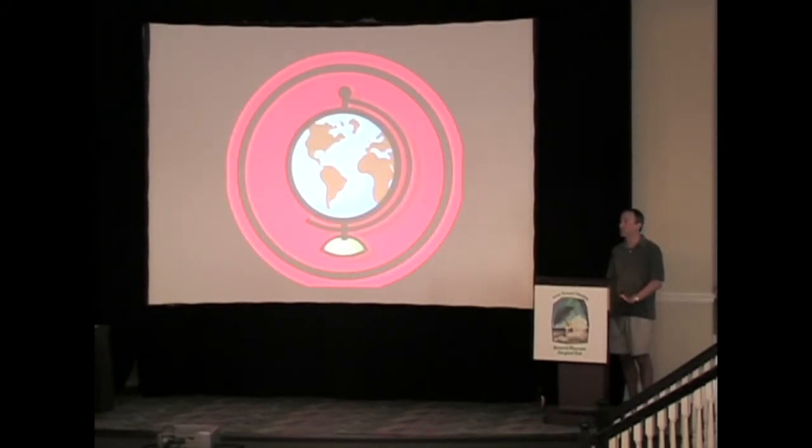And this image is just to remind me of the whole idea of global PACS. It's very important. I think a lot of radiology departments are set up to serve the needs of the radiologists best. And there's really been a paradigm shift now in terms of trying to provide optimal ability for non-radiologists to review images in ways that are convenient and meaningful for them, and to interact with the data sets in ways that they can plan procedures and discuss things with their patients in an optimal environment.